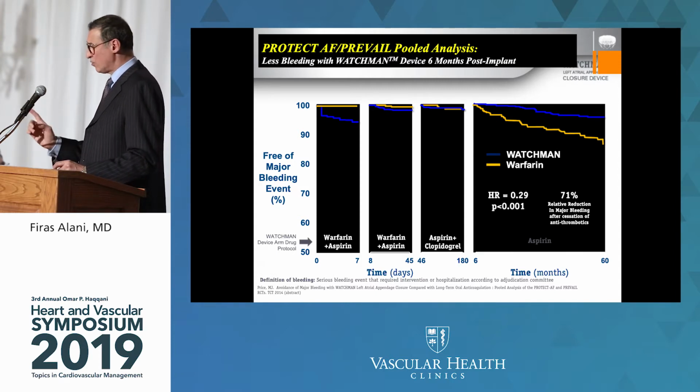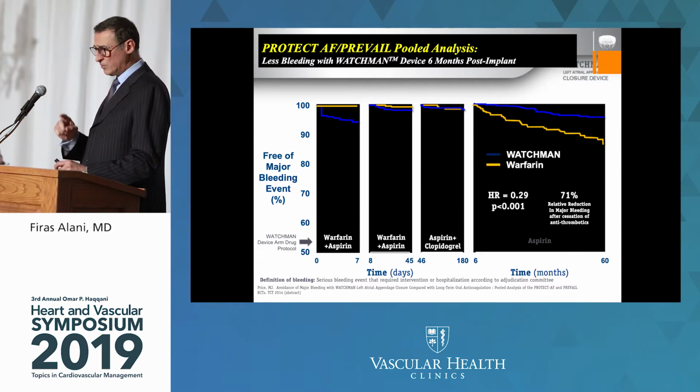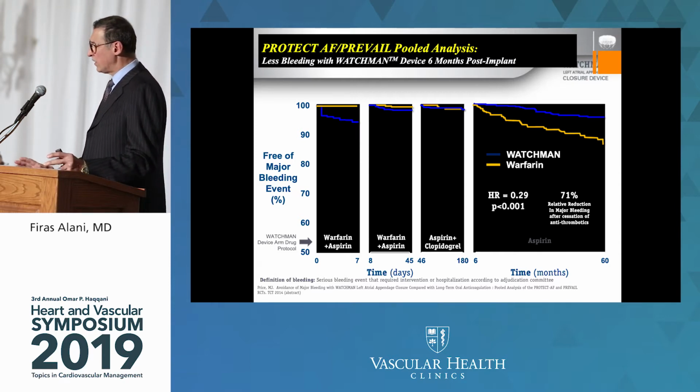They still have to take the Coumadin for 45 days because the risk of clot formation on the device is still a risk. So these patients will get the Watchman, they'll come back at 45 days, and we'll do a TEE. That's the day the patients look forward to, and that's the day you tell the patients you don't need the anticoagulation for the rest of your life.